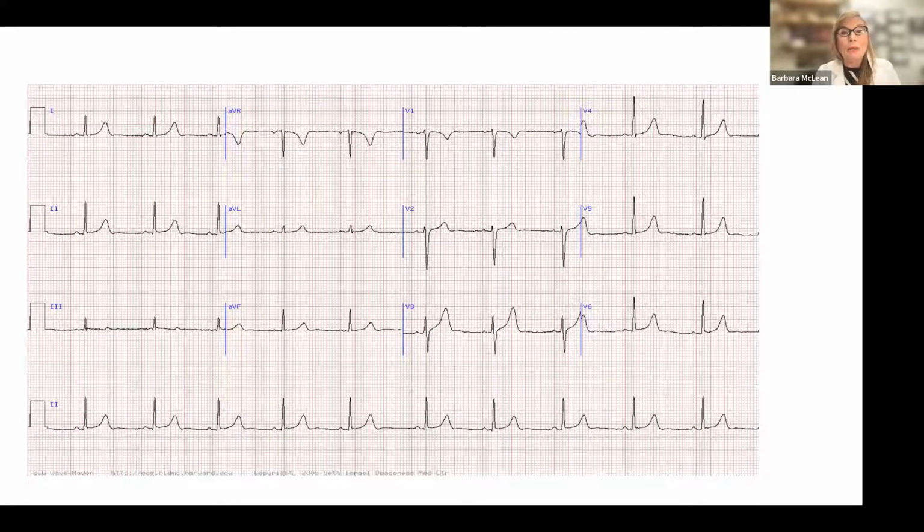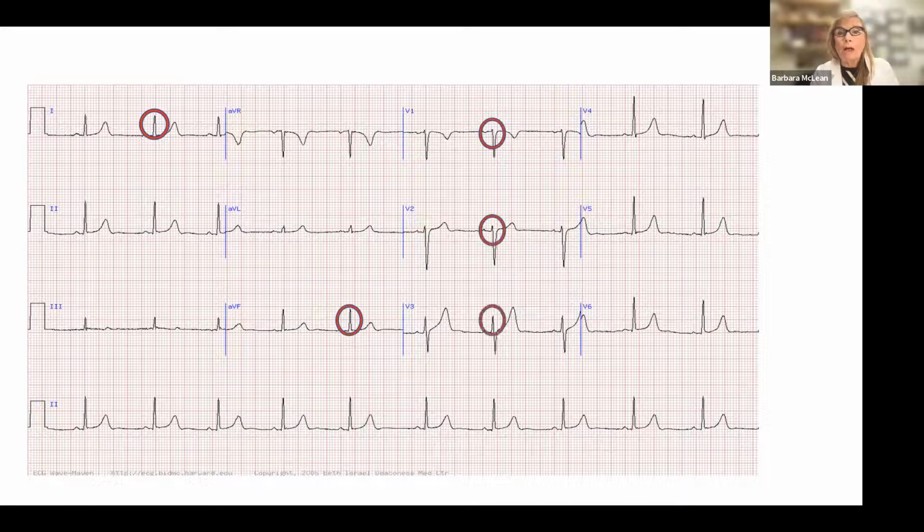Okay, so we go back to our patient from before, right? Normal axis and little r, a little bit bigger, and zone of transition, V4. So good R-wave progression with zone of transition in V4. That's your zone of transition where the upright is bigger than the downwards.